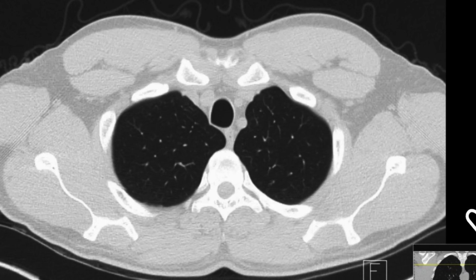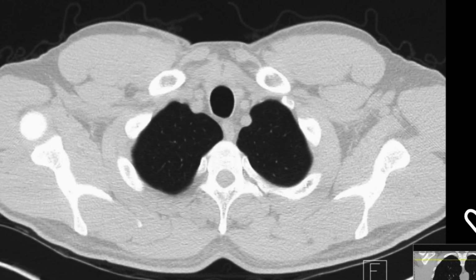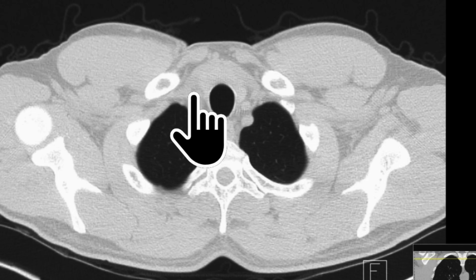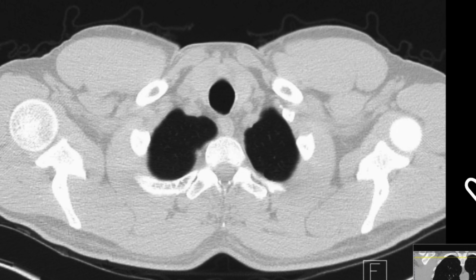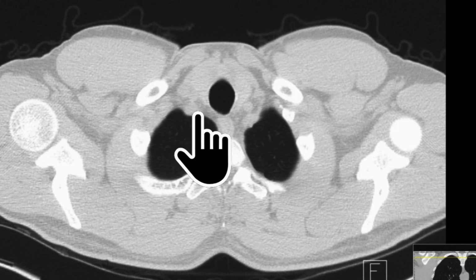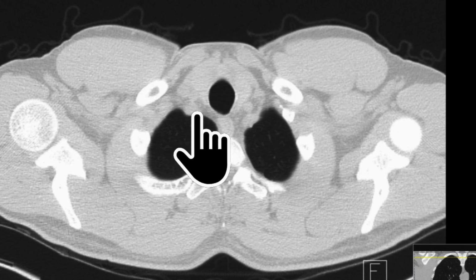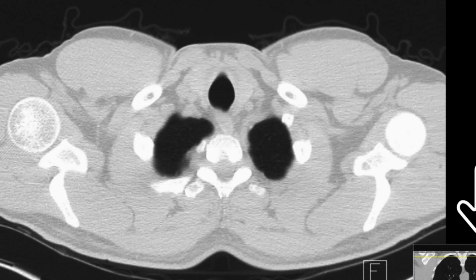Oh, yeah, I reckon I got money on it. Oh, it's starting to divide there, can you see? It's starting to divide. Now we've got 2 circles. So I'm jogging up and down a little bit there. Oh yeah, and this one is changing shape because it's starting to go off this way to the upper limb, but this one is staying round.